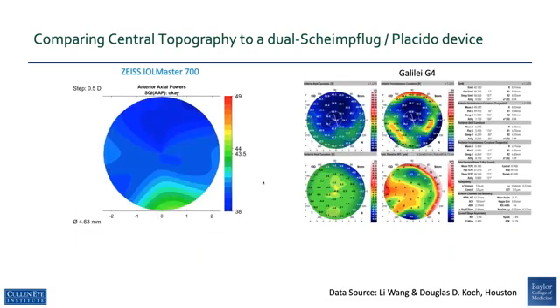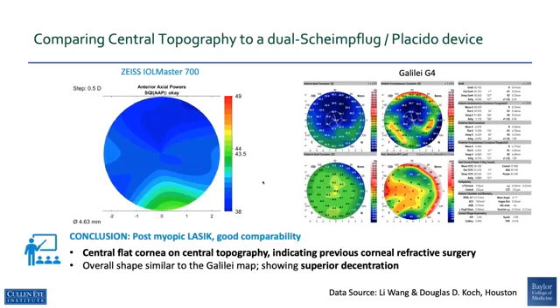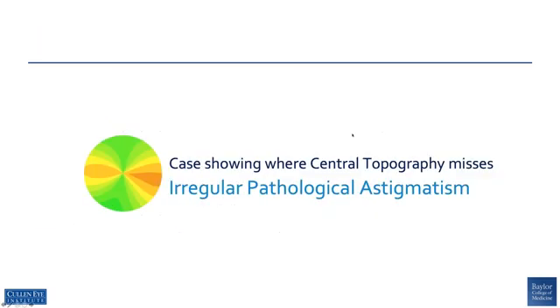Here is a cornea that looks very flat — in fact, it's a post-LASIK cornea. Again, there is very good comparability between devices. The cornea is flat, and the inferior zone is steeper than the central and superior zones, indicating superior decentration of the ablation, seen very comparably with both devices.